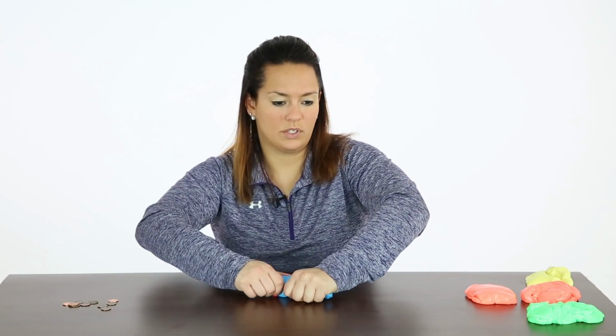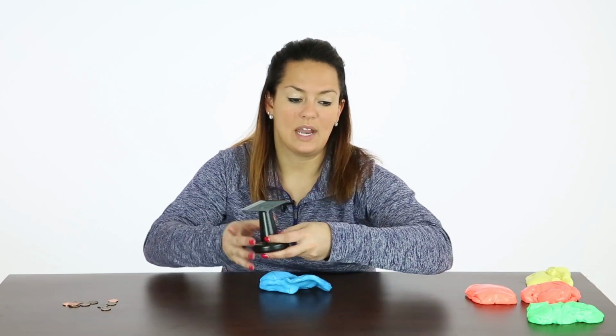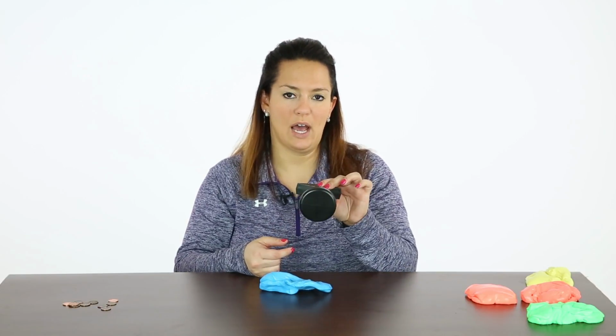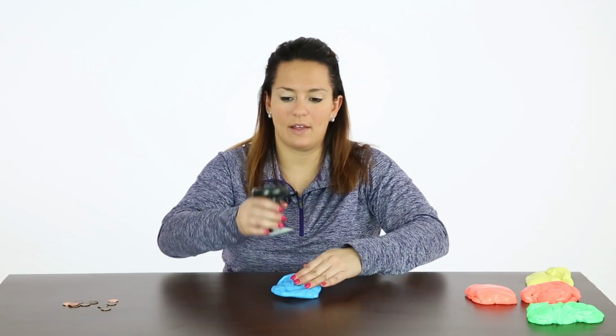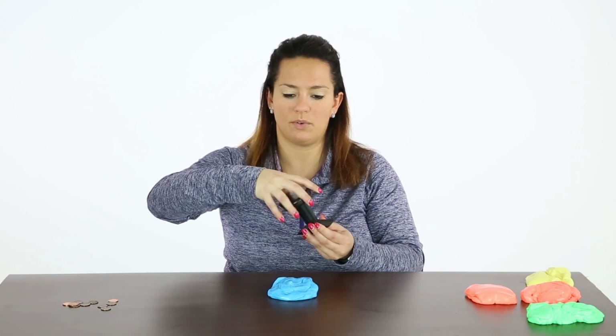And we're going to use the putty size knob turner. So we had the cap turn before that was a smaller diameter circle. This is a knob for simulating a doorknob or something larger, a peanut butter jar, anything like that that would require more of a cylindrical grasp. So we're going to use all of your fingers for this rotation.